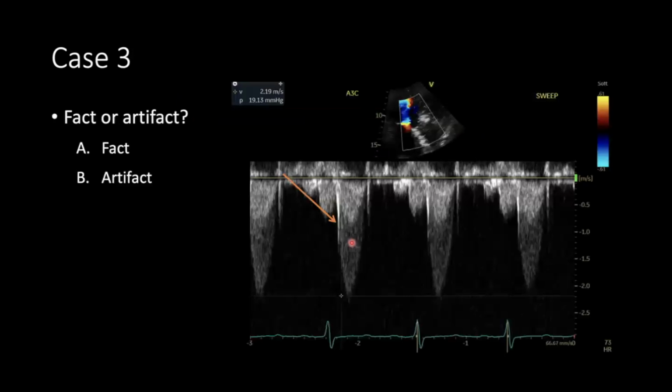But we've seen that in our NHL young people scanning. Oh, really? I think for those of us who have done this, anywhere between 16 to 18, when you have really good probes, you can actually follow the whole coronary artery. Oh, I think Dean did a lot of that during the time when we did the NHL scanning. That's cool. Okay, so what we're interested in is that Doppler envelope there.